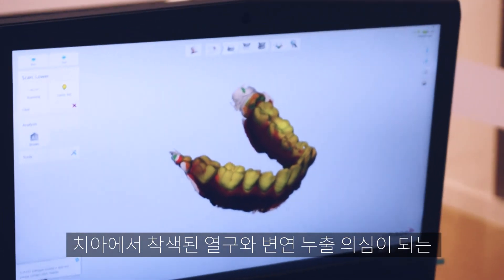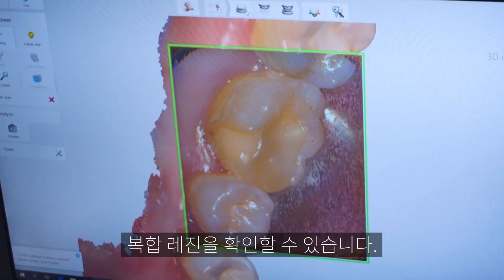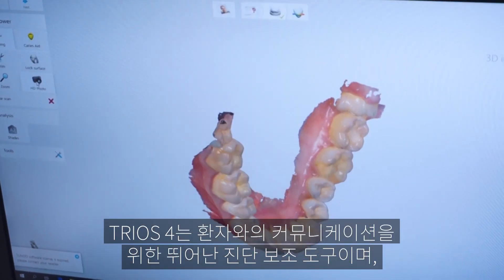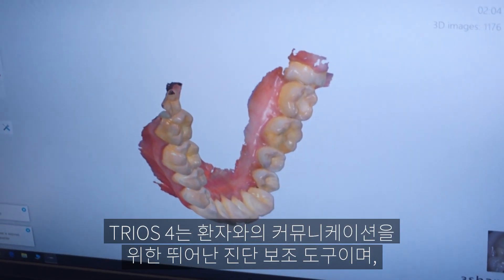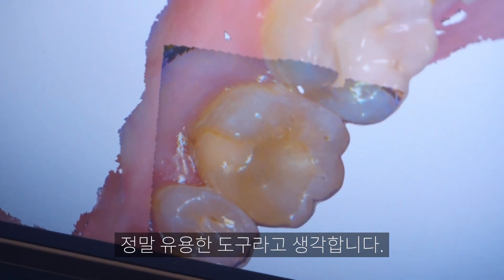You can see a large composite restoration with a stained fissure showing signs of early leakage. This is a really good diagnostic aid for patient communication — you can show patients this.